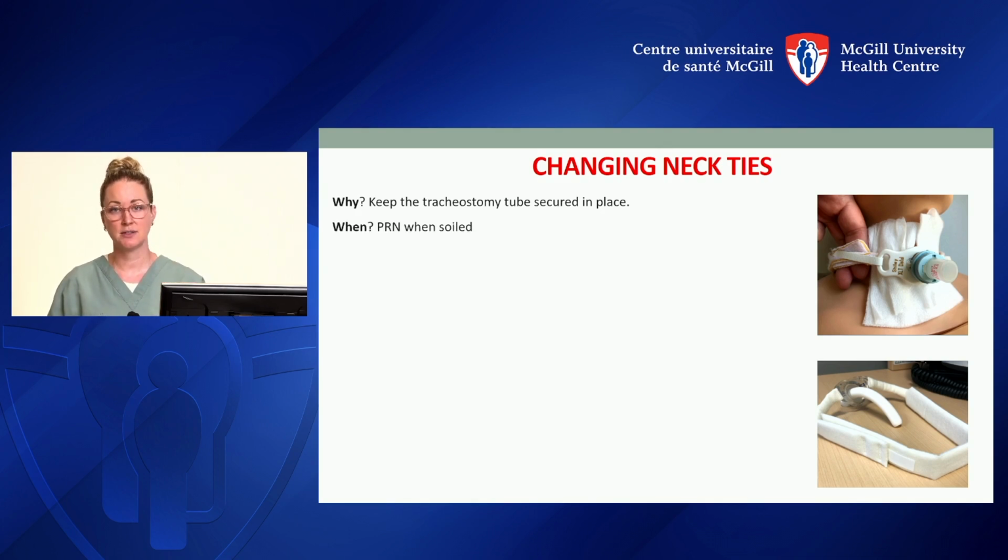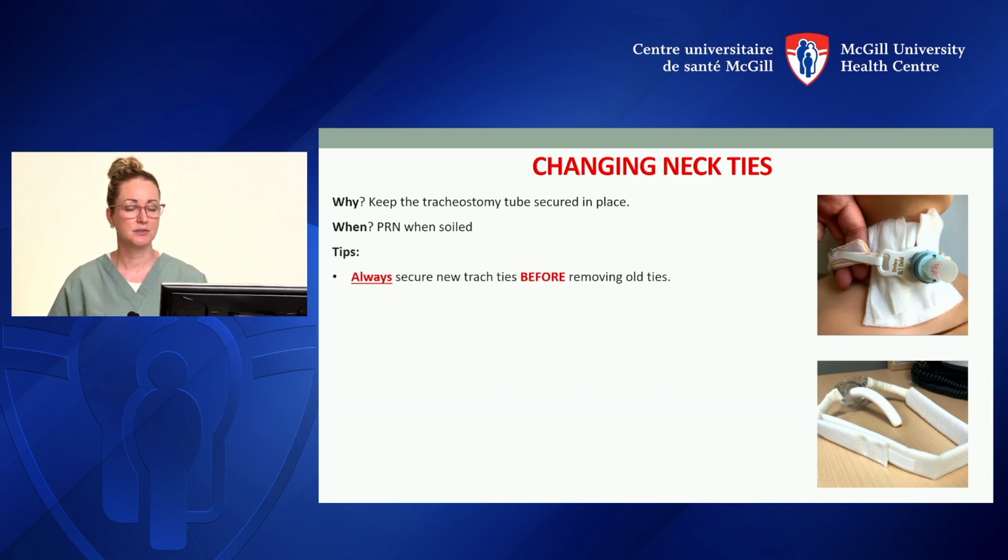When do we change the neck ties? It's only on an as-needed basis, either when the Velcro is not functioning or not sticking properly, or when they're soiled. Otherwise, if we change it more often and we don't need to, we're just increasing the risk of an accidental decannulation. So some tips.